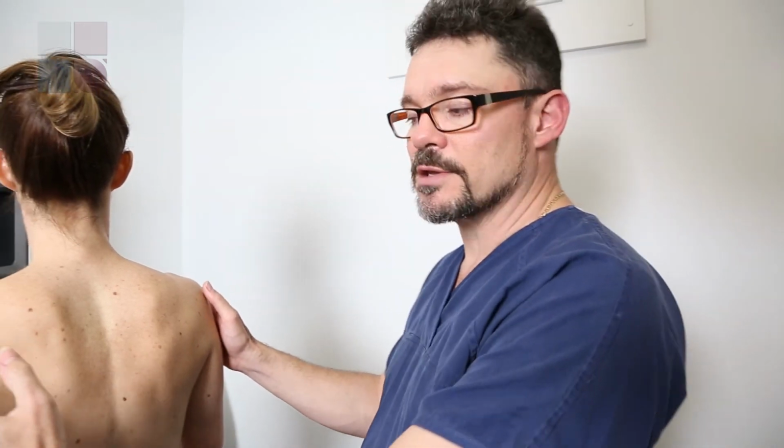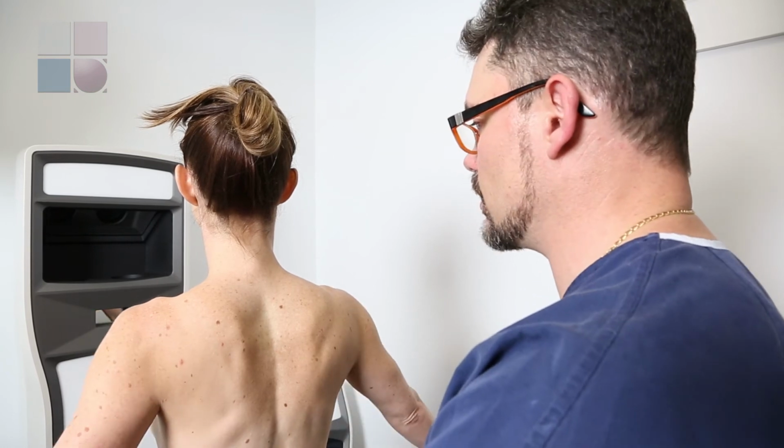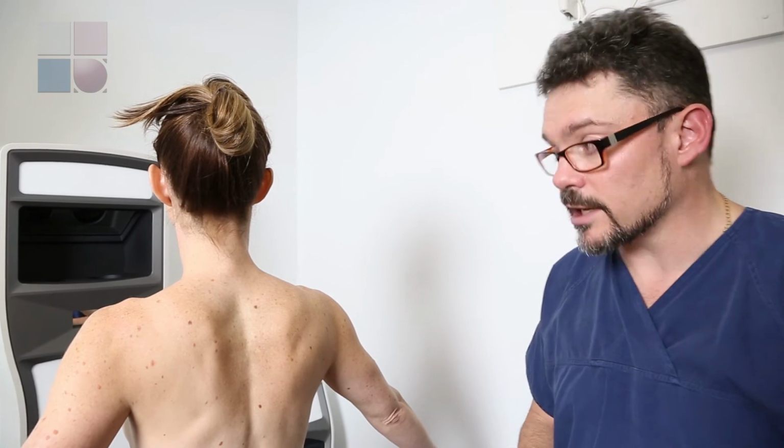So we position our patient in front of the Vectra like this. Positions right, just pop your arms out at 45 degrees there, and we have the patient in position. We just take our image capture.